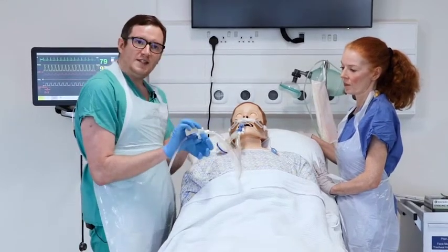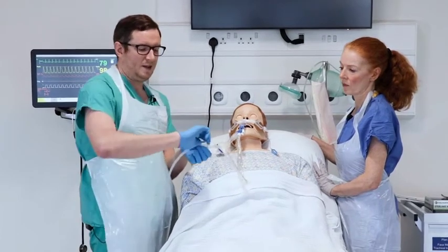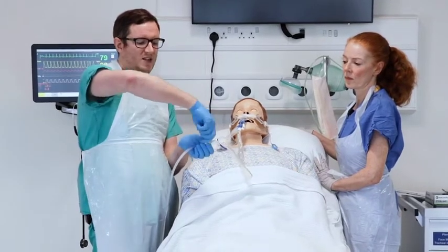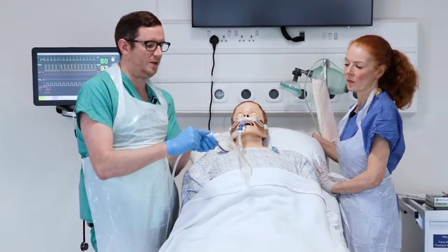You may find that when you depress the suction catheter, it does not move because there is a locking mechanism. To deactivate that lock, simply turn it 180 degrees and you will then be able to suction through it.